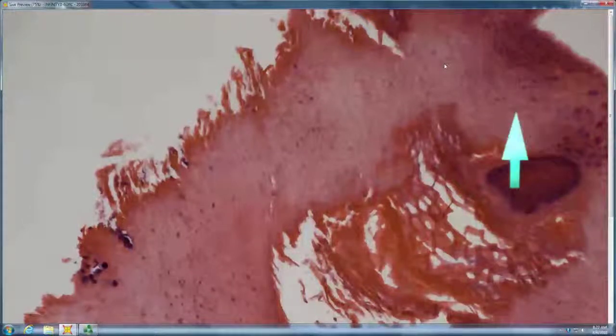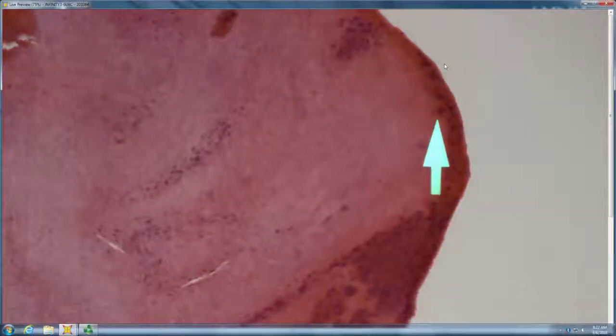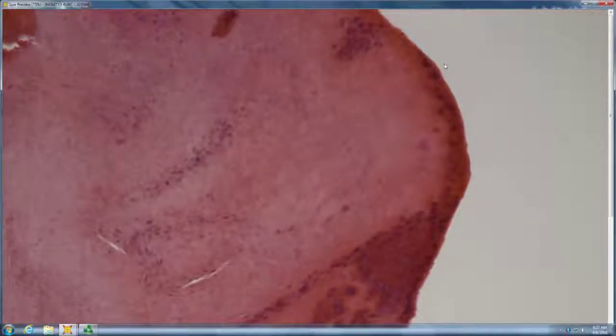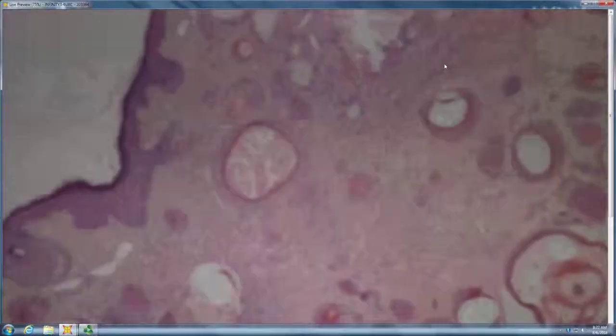Fairly abrupt keratinization, similar to what you would see in a pilar cyst. So do you know any horn that has trichilemmal keratinization? A trichilemmal horn. Right? So trichilemmal horn is a cutaneous horn. It's a benign pilar tumor forming a cutaneous horn. It has trichilemmal keratinization. It's called trichilemmal horn. A pretty descriptive name. And those are benign.